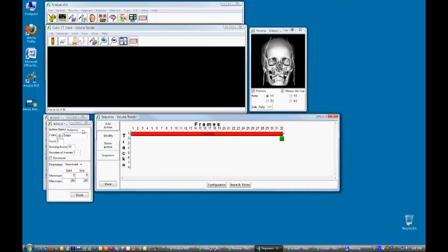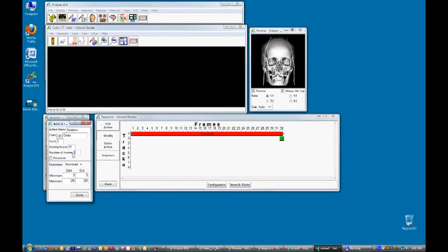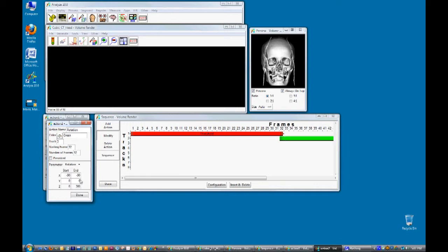Next we will add a rotation action. Rename the action name to rotation and then set the number of frames to 32. Set the parameter from threshold to rotation. The default parameters here will provide us with a Z rotation of 360 degrees.